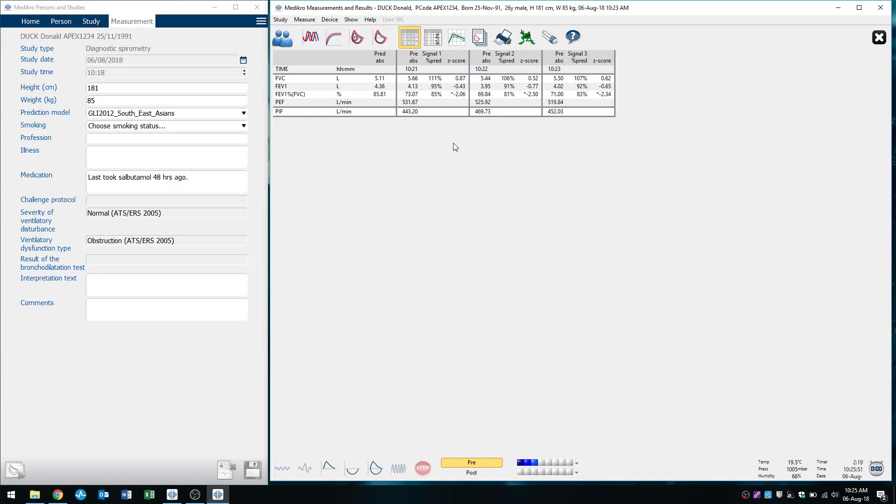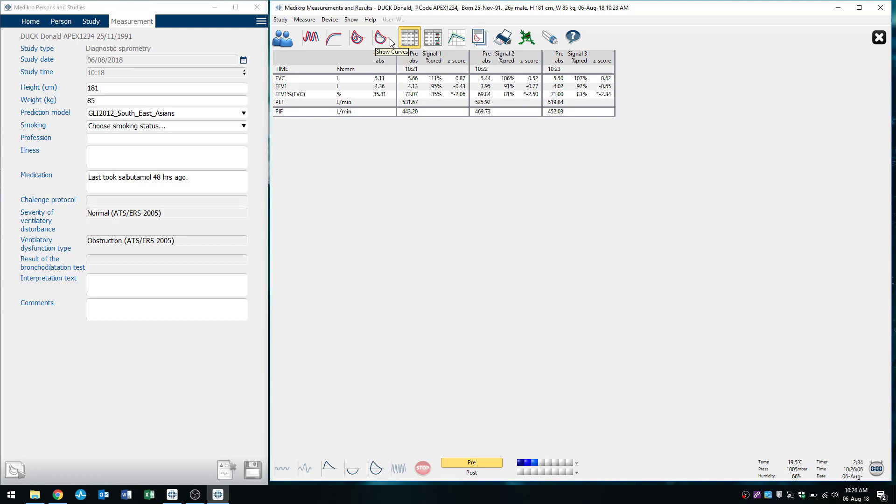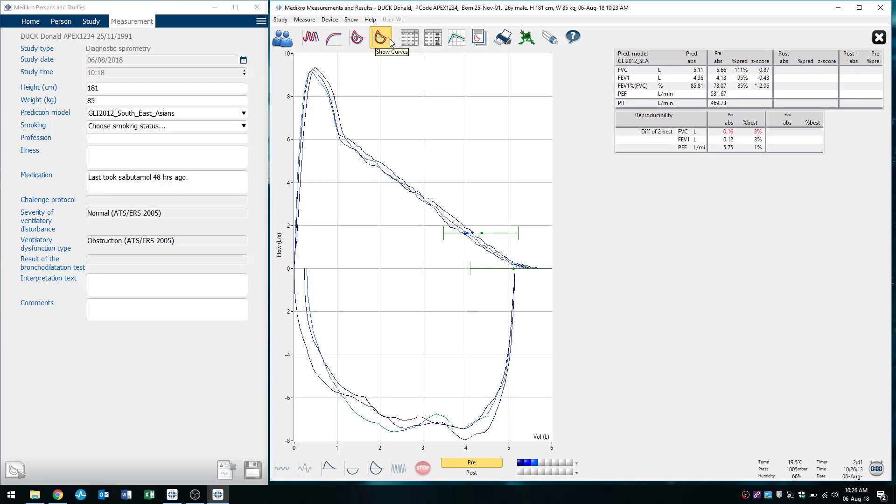But you can see here that my FVC, the two highest values, 5.66 and 5.50, that's 160 mils off, so that's not quite acceptable. So at this point you would probably instruct the patient to do one or two more blows just to try get nice, acceptable and repeatable values.